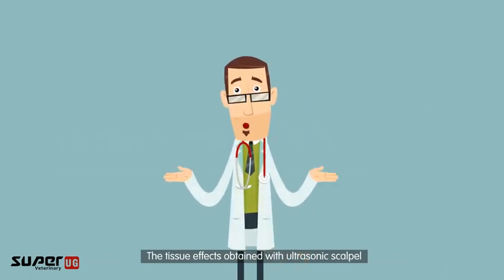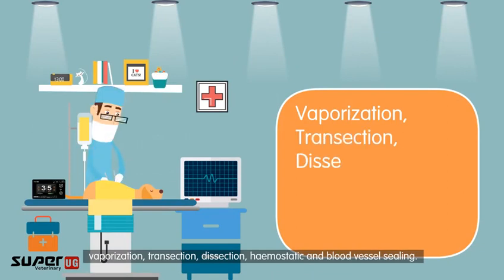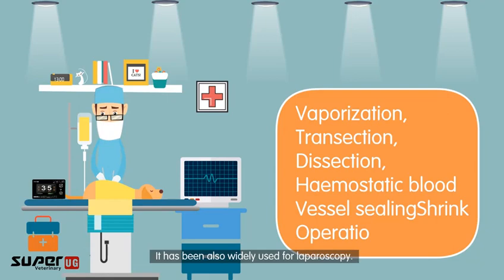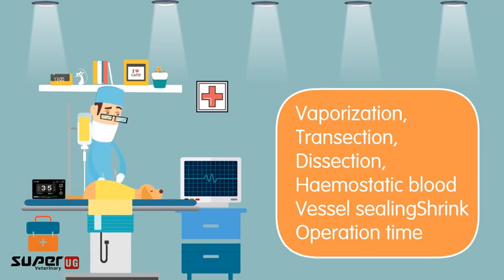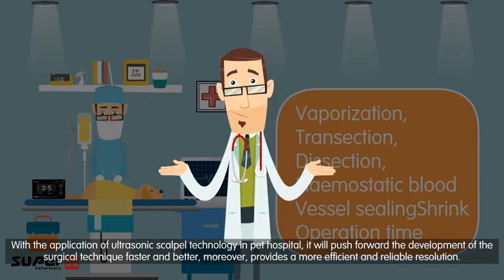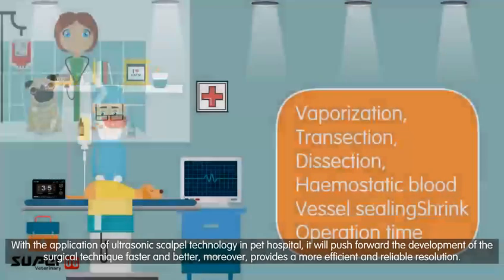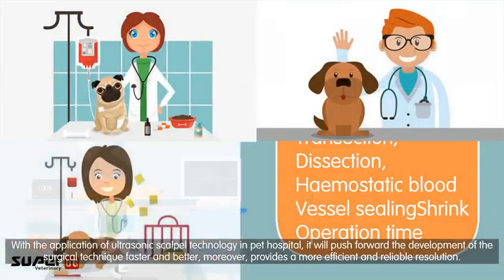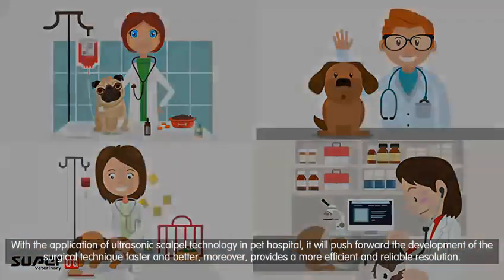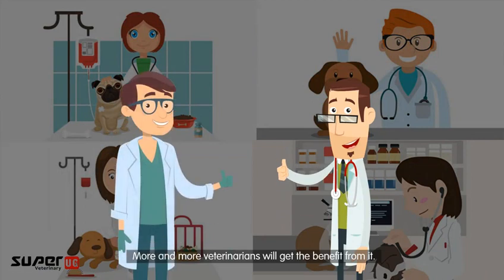The tissue effects obtained with the ultrasonic scalpel include vaporization, transection, dissection, hemostasis, and blood vessel sealing. It has also been widely used for laparoscopy. With the application of ultrasonic scalpel technology in pet hospitals, it will advance surgical techniques faster and better, providing more efficient and reliable outcomes — and more and more veterinarians will benefit from it.